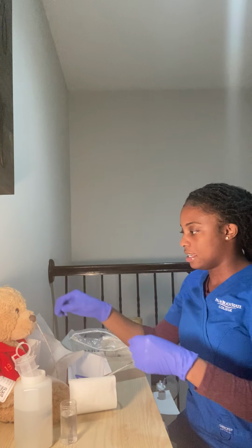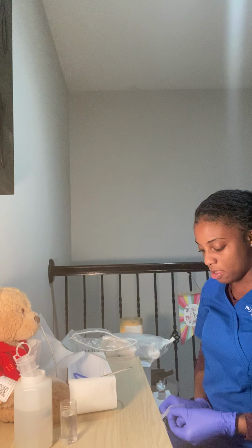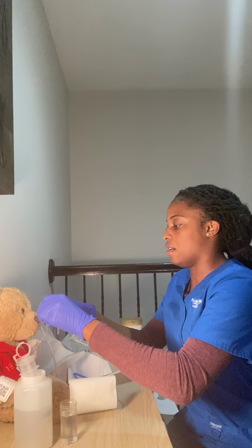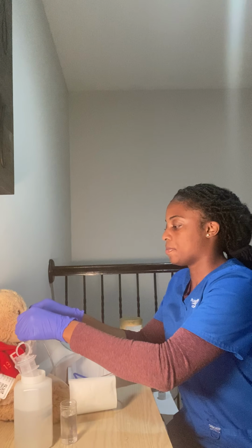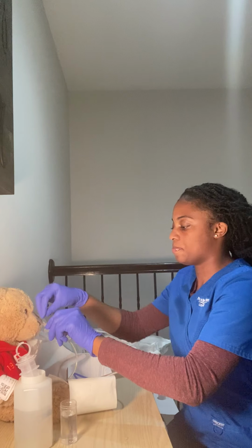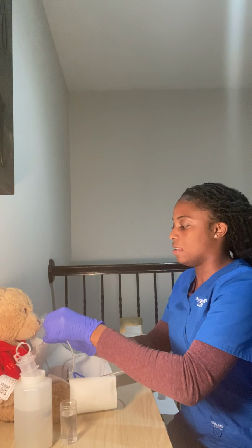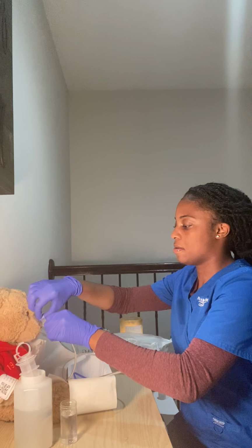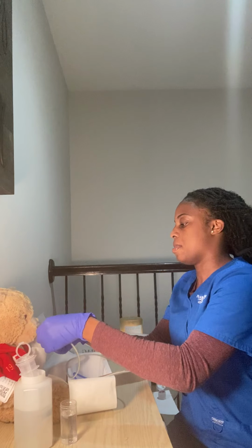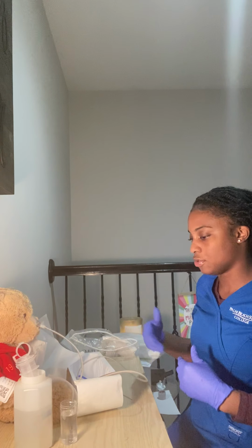Once I have that done, I can remove this tape, or I can keep it on, but I'm gonna go ahead and tape it using my pants leg tape. Just going to sit this on the bridge of the nose. Then I'm going to wrap one side around my catheter. Then the other side. There we go. Okay. And then I can go ahead and have an x-ray ordered.